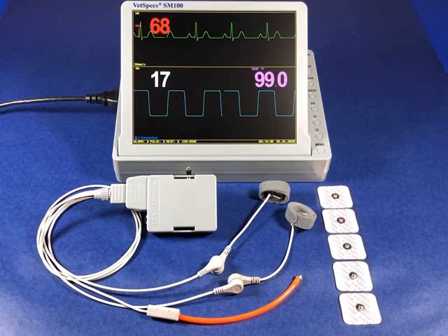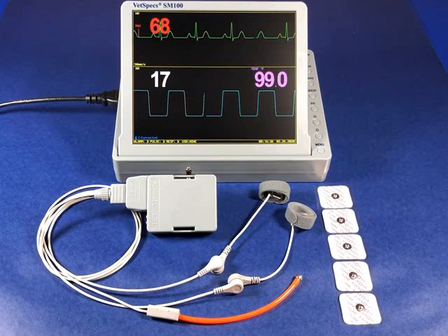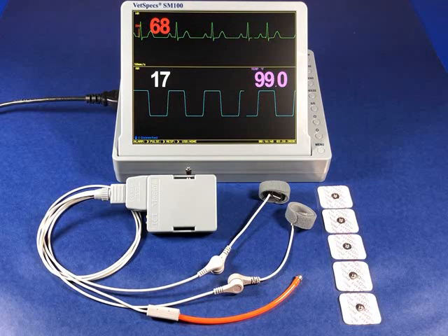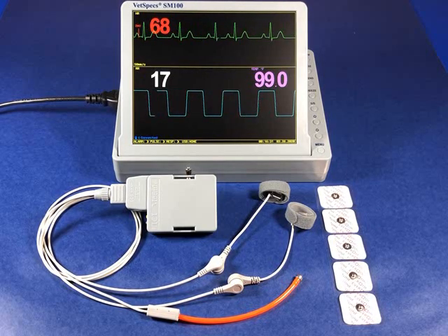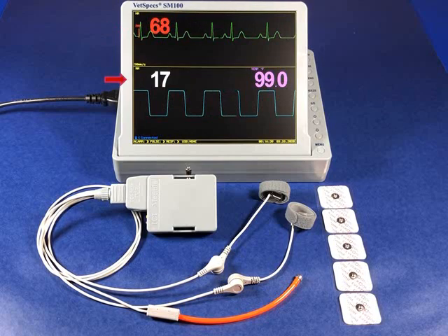Regarding the two-wire ECG leads, the standard limb plates may be easily removed via the snap contacts and replaced with the patch electrodes. Each patch may then be applied with diagonal positioning to the abdominal or chest wall regions of a clipped patient. Once connected, the monitor will display heart rate with ECG, respiratory rate with impedance waveforms, and rectal temperature.